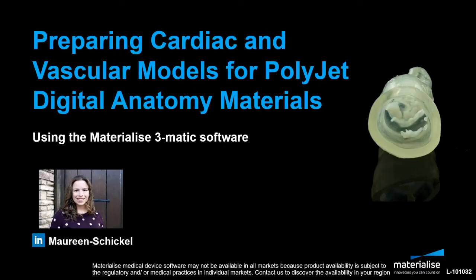Hi, this is Maureen Schickel. In this tutorial, we will talk about how you can prepare cardiac and vascular models for 3D printing with the PolyJet Digital Anatomy materials using Materialize 3Matic.